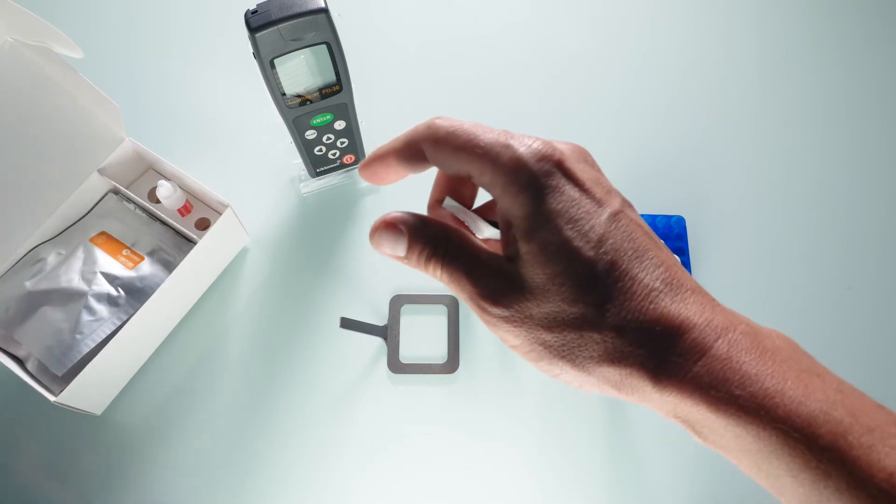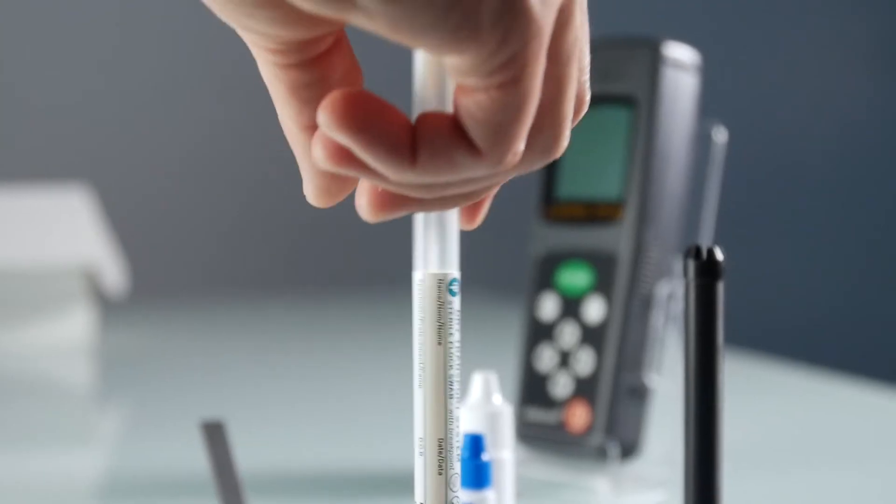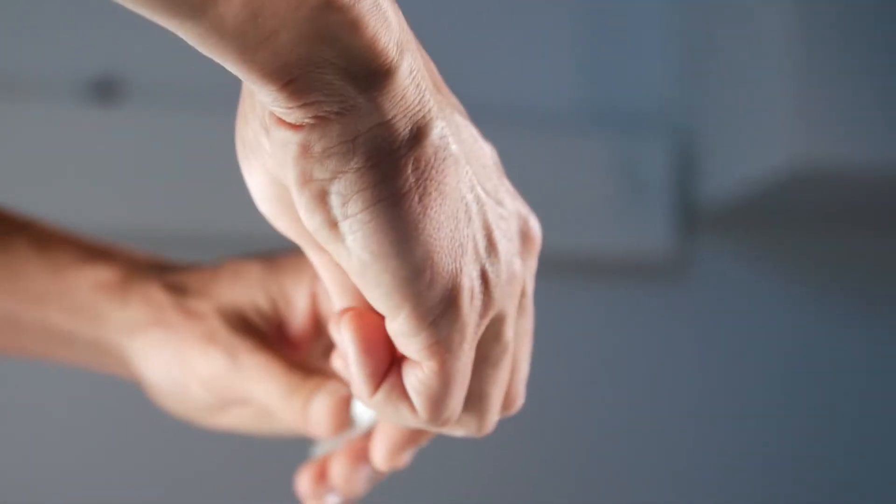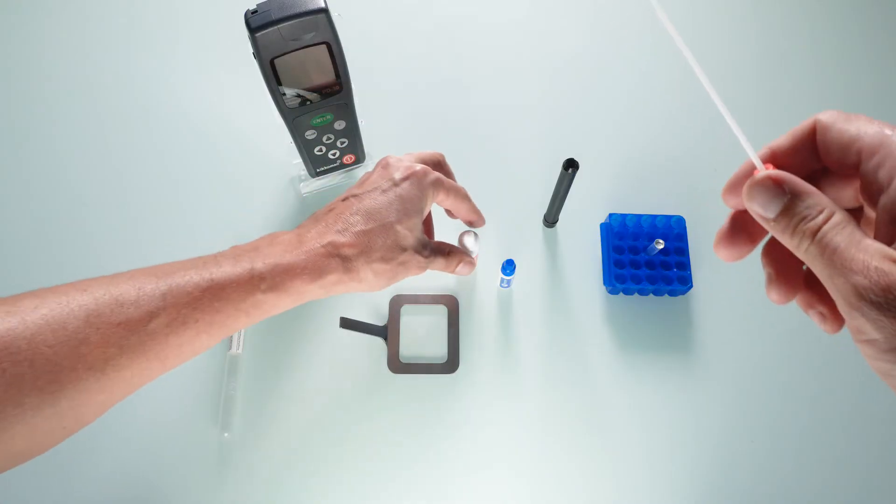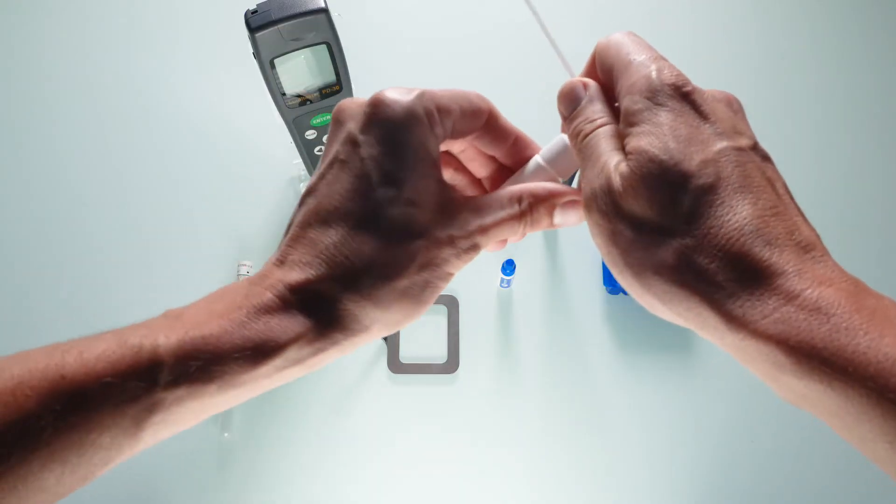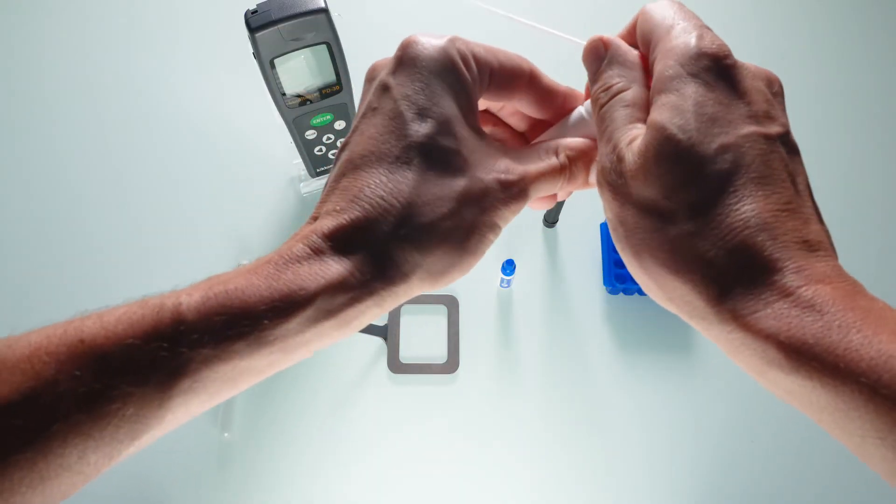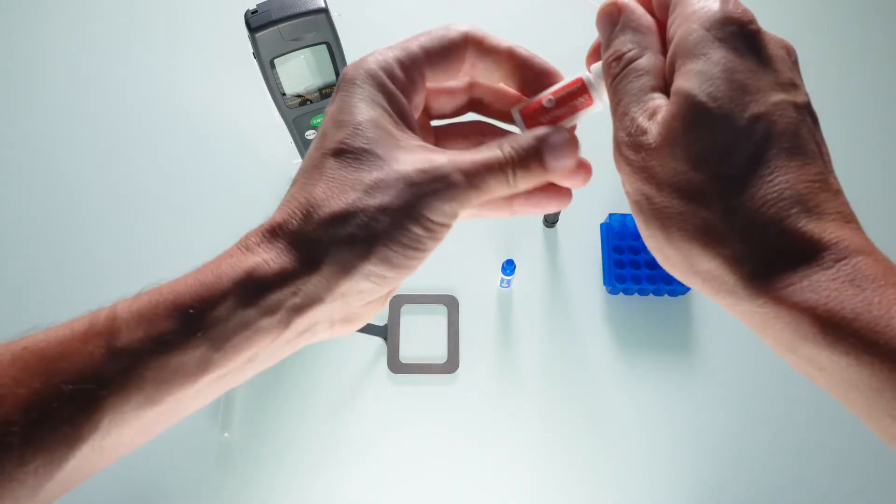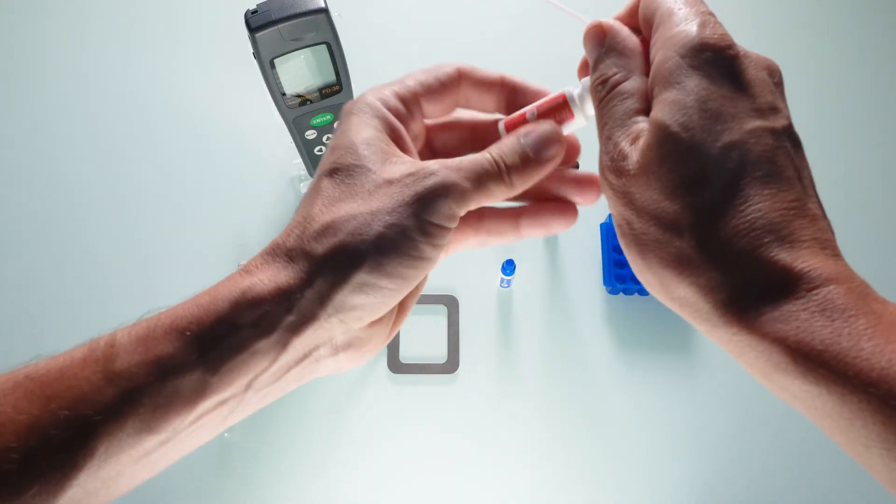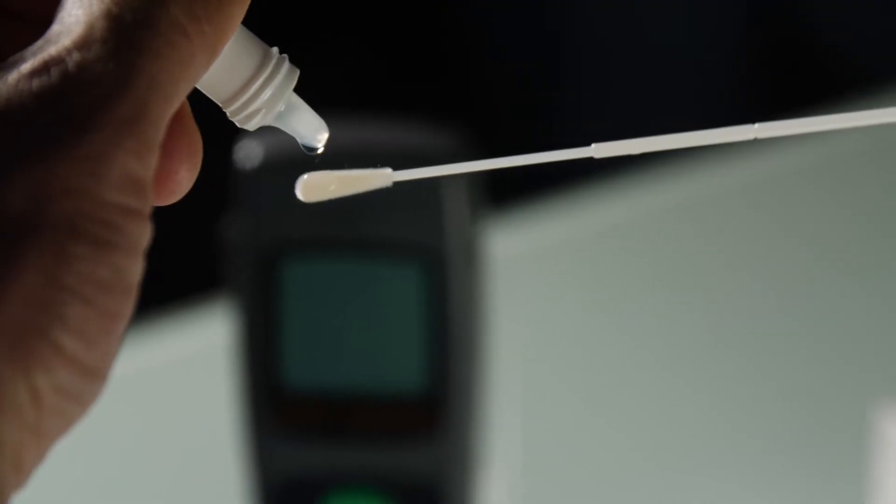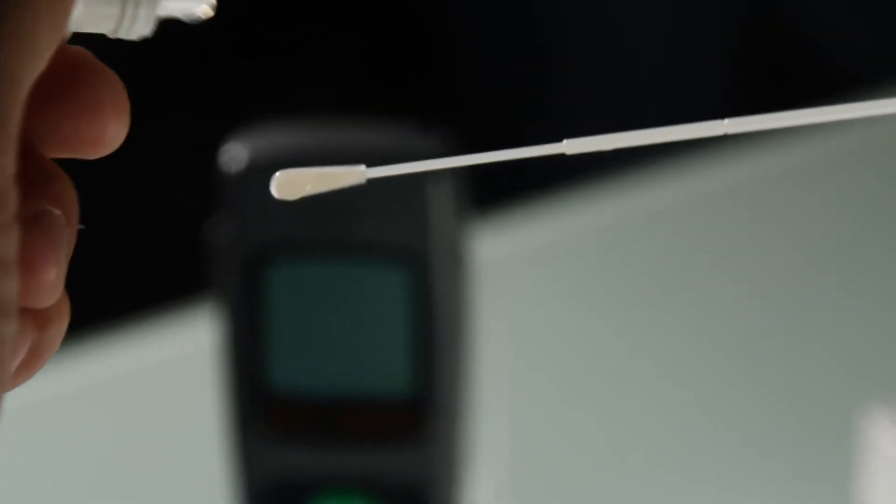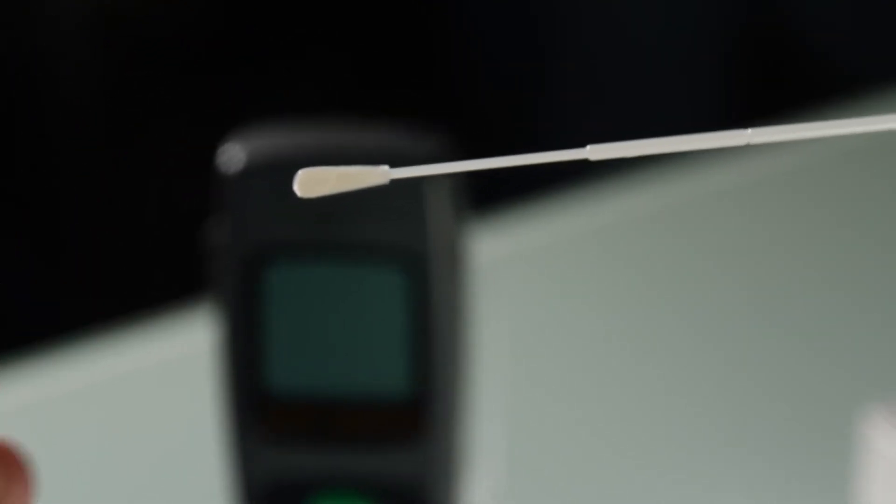Unpack a sampling swab, being really careful not to touch the tip. Squeeze two drops of extractant onto the tip of the swab.